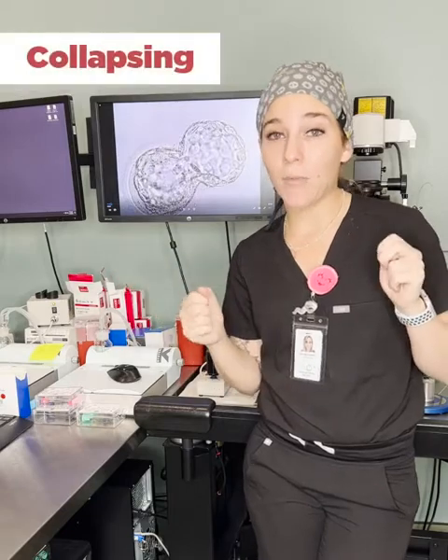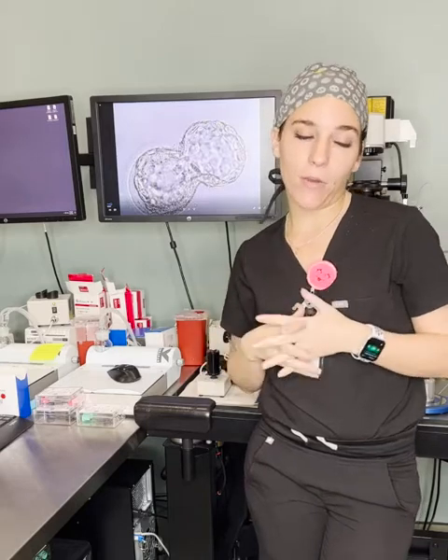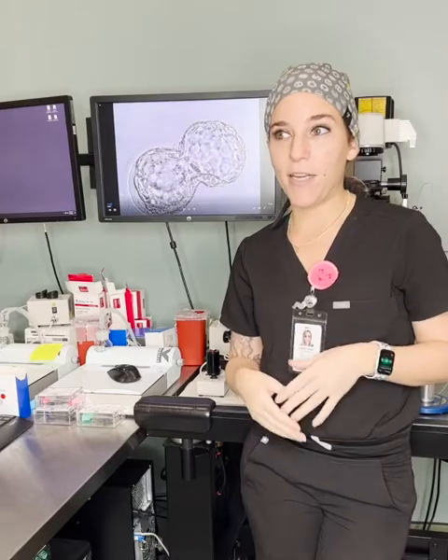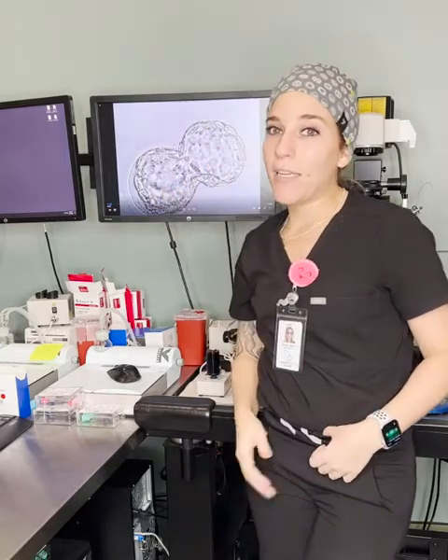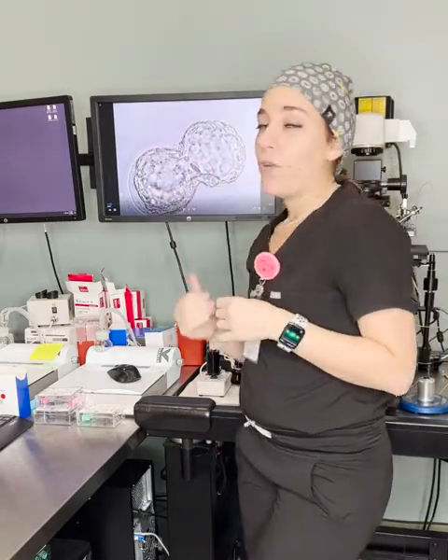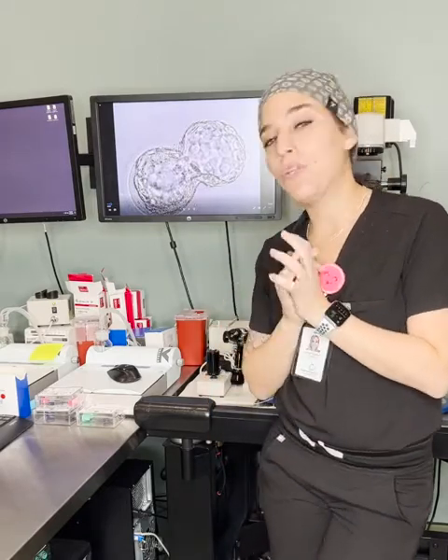So, the first kind of assisted hatching that we like to call collapsing is on a blastocyst that we are about to freeze or vitrify. I did take a video of an embryo that I collapsed right before freezing. The whole point of collapsing an embryo before you freeze it is because the inside of the blastocele, so here and here, is composed mainly of water. So, when we freeze this embryo, if we don't collapse it, this is a very controversial issue. I know throughout the years people have gone back and forth about whether or not they should collapse or not. They don't think that it causes harm to the embryo. However, does it cause harm if we don't collapse?